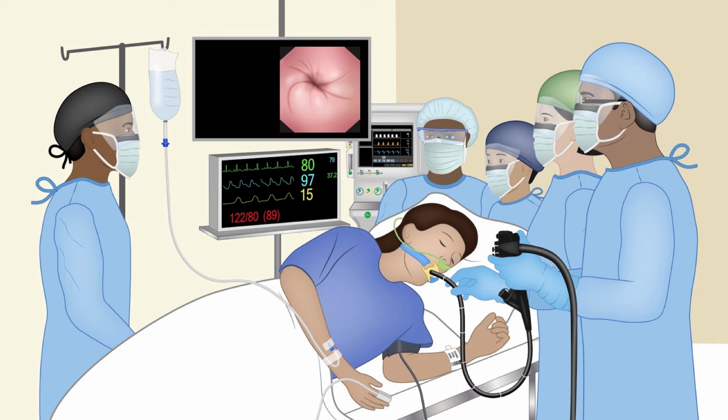So as the endoscopist is doing the procedure in the esophagus, when he reaches the lower end of the esophagus, he will call out certain measurements to define the anatomy of the lower esophageal sphincter and its relationship to the diaphragm and what is happening to the junction between the squamous lining and the columnar lining of the esophagus.